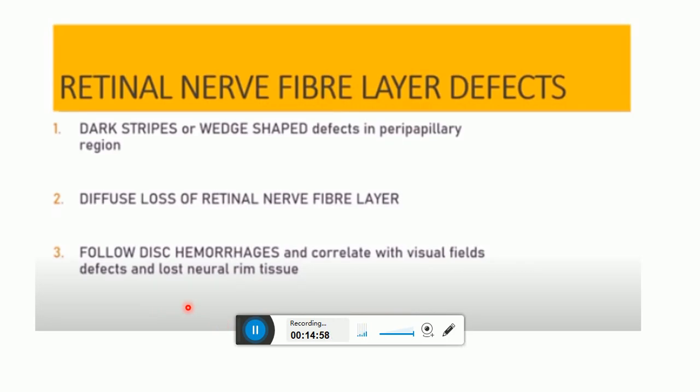The retinal nerve fiber layer defects. In glaucoma, the subtle RNFL defects precede the development of detectable optic disc and visual field changes. Their onset often follows disc hemorrhages. Two patterns occur: localized wedge-shaped defects, and diffuse defects that are larger and have indistinct borders.